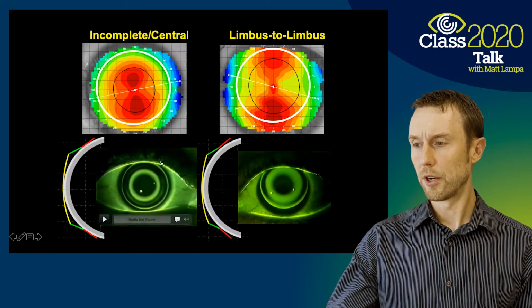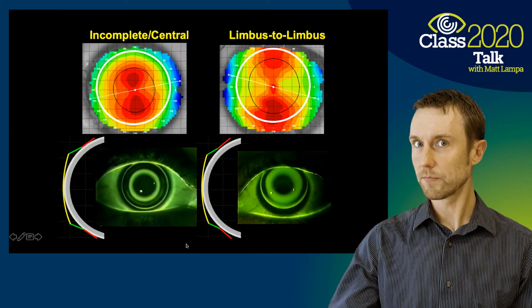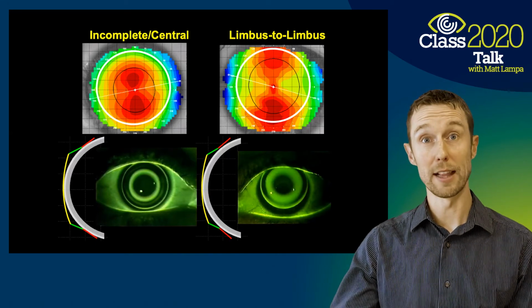Well, the orthokeratology fit here on the bottom really gives us some clues, in that the prediction for that central astigmatism was that the lens should land equally 360 degrees around, and that's exactly what happens.